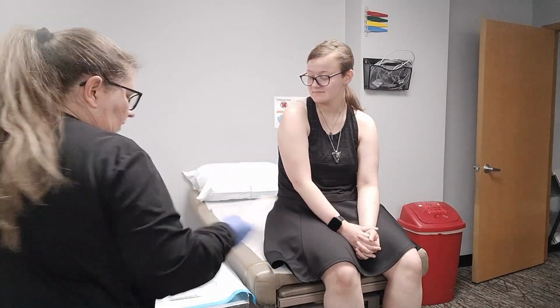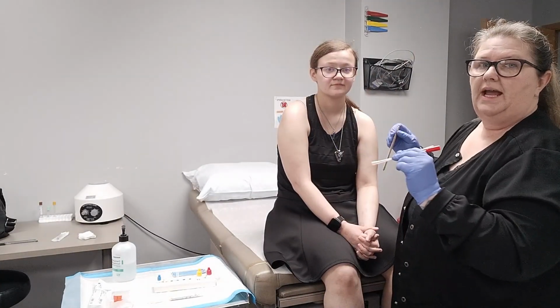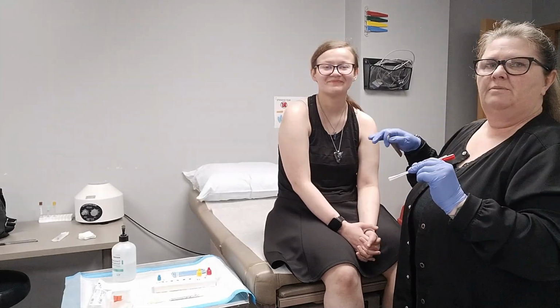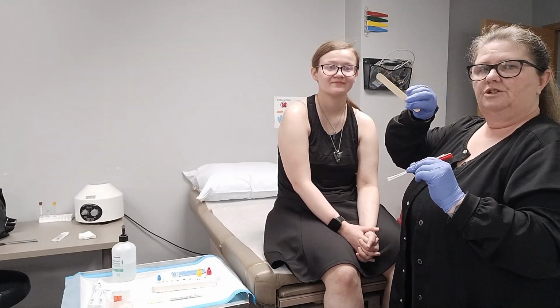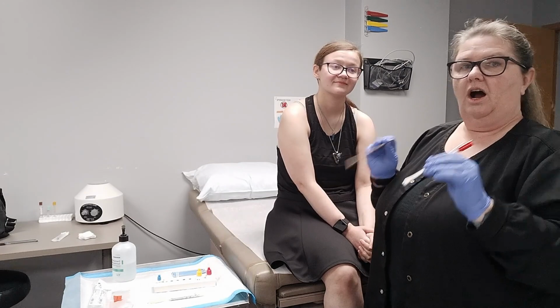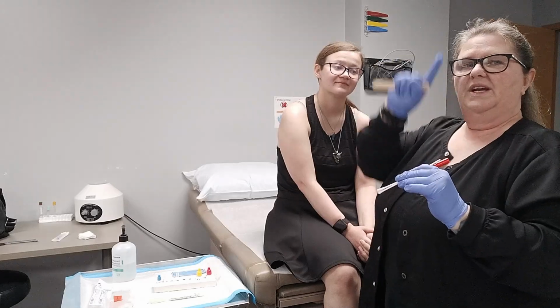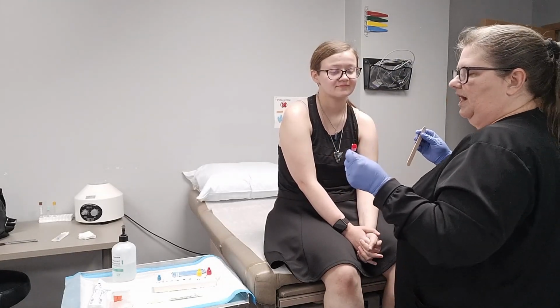All right. Now, when I ask her to, I'm going to go ahead and ask her in a moment, don't do it yet, to open her mouth, stick her tongue out, and I'm going to put this tongue depressor on her tongue, and I'm going to ask her to say ah. The reason we have our patients say ah is because when you do that, your uvula in the back of your throat raises up, okay? So here in a moment, I'm going to do that.